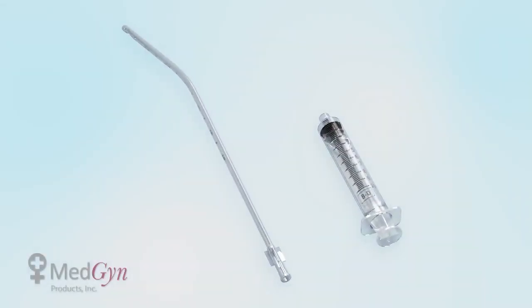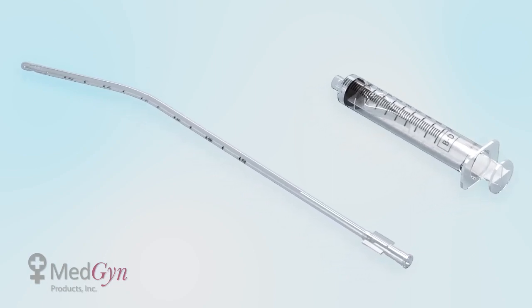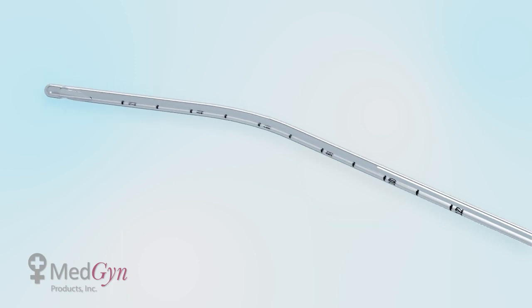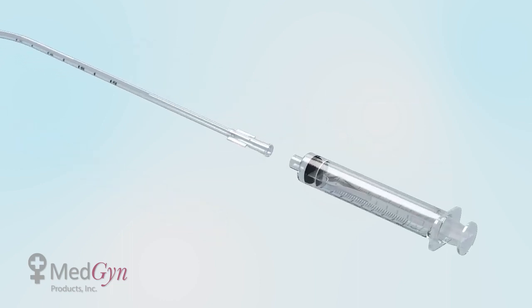The Medgyne Endosampler is an effective device used for endometrial biopsies. The device consists of a semi-rigid 3 mm curette and a 10 cc syringe with a locking mechanism to give an accurate and abundant sample.